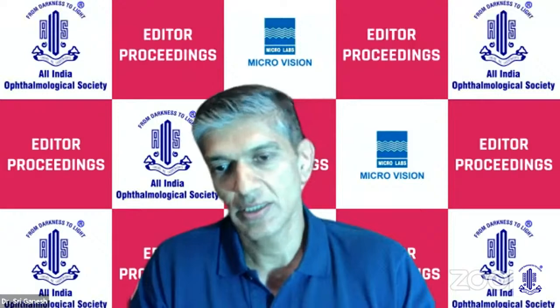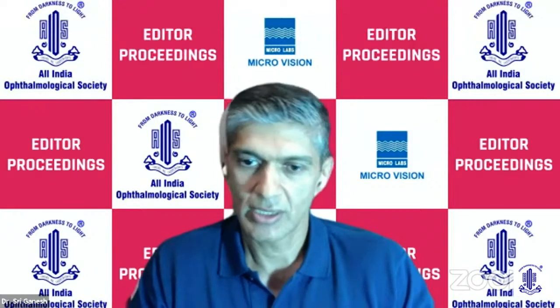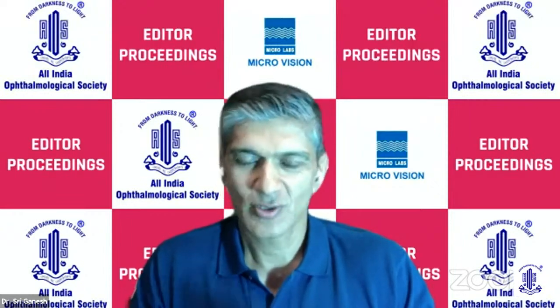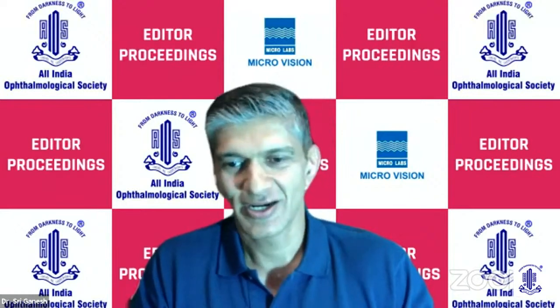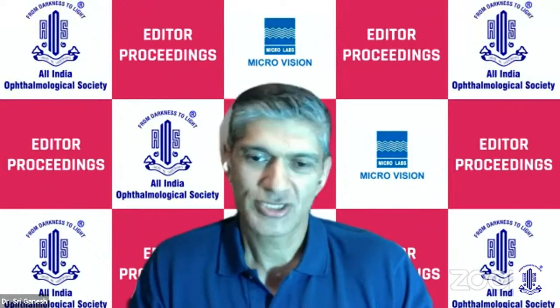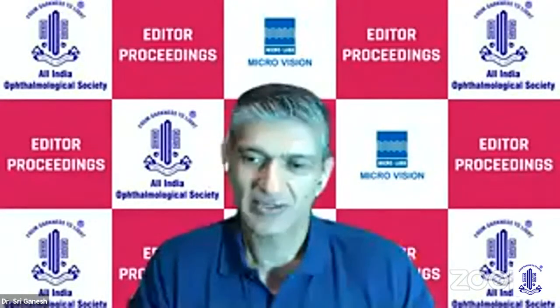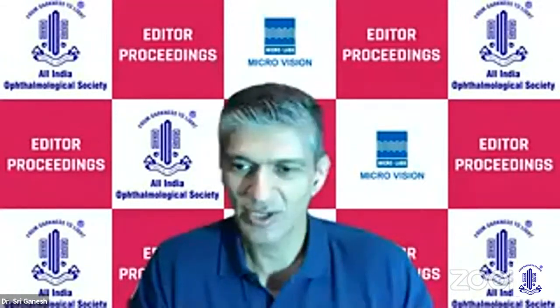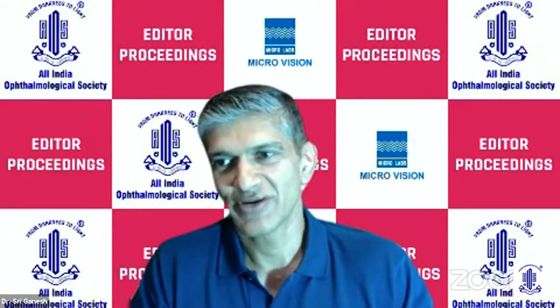So ideally, in our practice, we always deal with the pterygium first before doing the biometry, and allow the tear film to settle. There's another very interesting story. A couple of years ago, when we got our IOL Master 700 and they installed it, our biometrist was taking the K readings, and we also were checking with the other device, the IOL Master 500, and the keratometry. And then they came to me and said somehow the IOL Master 700 is not very accurate. We are getting different K readings.